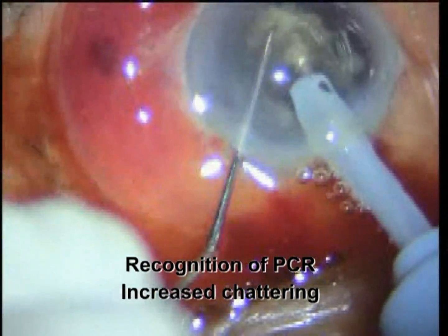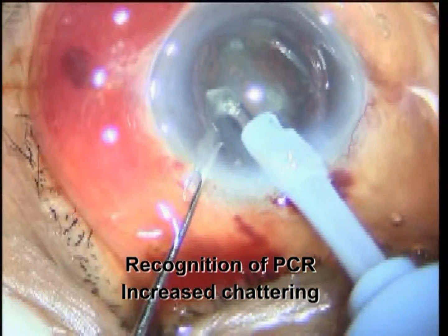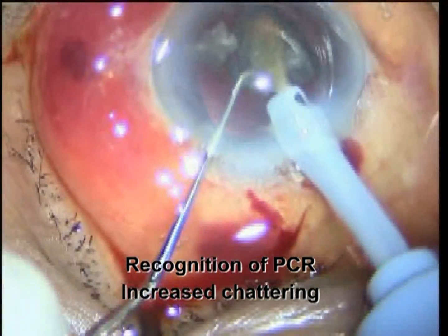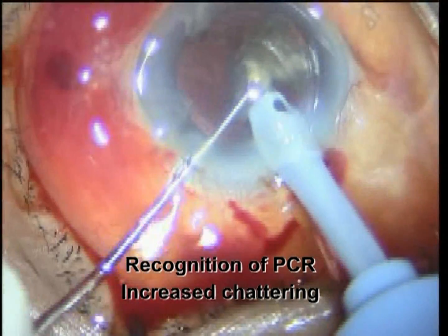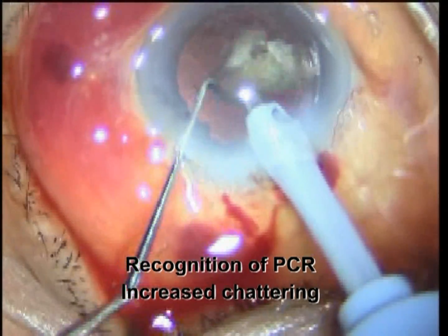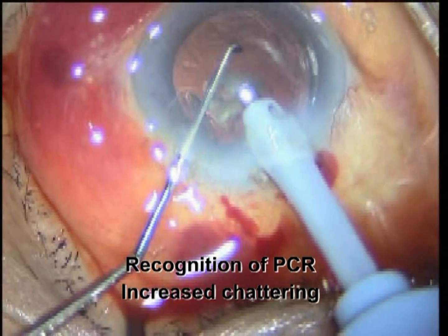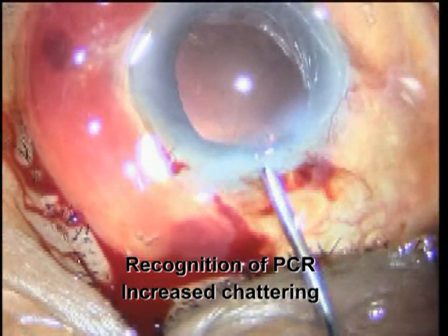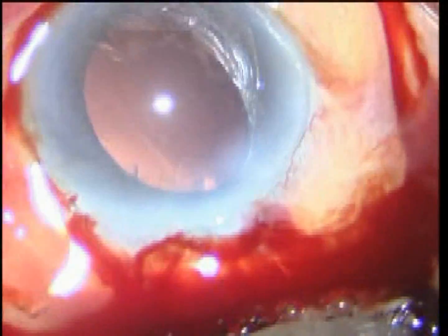This case shows how increased chattering is a sign of PCR. Here we can see the increased chattering. After completing the phacoemulsification the probe was removed, and when the probe was removed and viscoelastic was injected, we could see the posterior capsule rent. Increased chattering is a definitive sign of PCR.